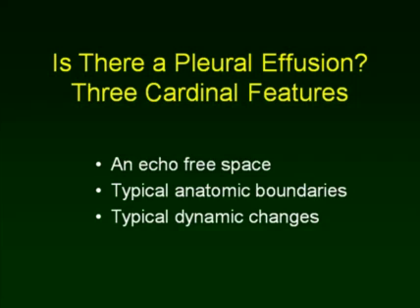The first would be an echo-free space. The second is that this echo-free space is subtended by typical anatomic boundaries. And thirdly, that there'll be typical dynamic changes that are consistent with pleural effusion.